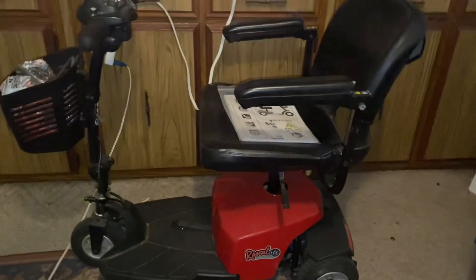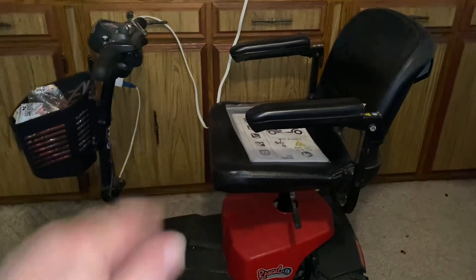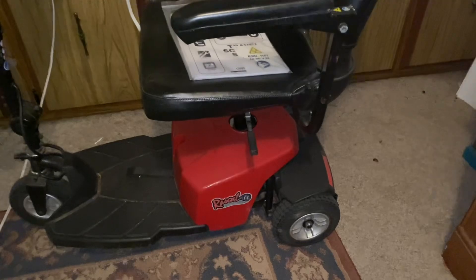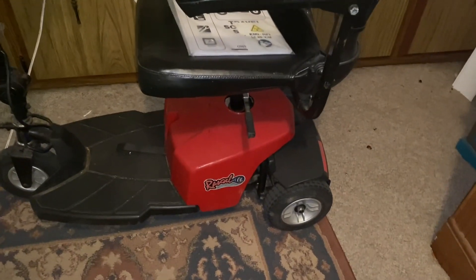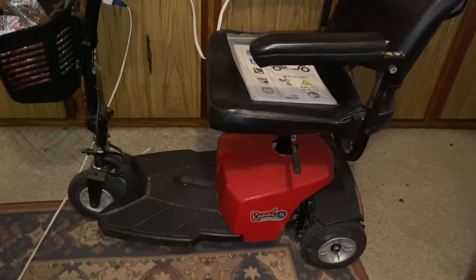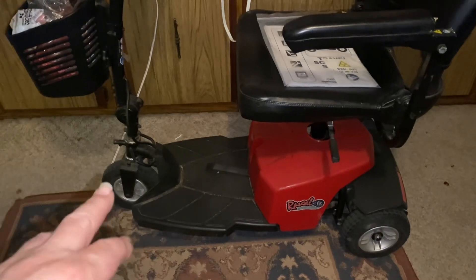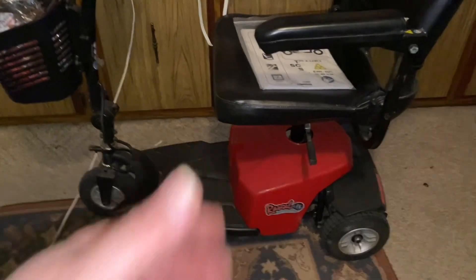The seat comes off — it comes into different pieces so you can fold it up and fit it in your trunk. Now this was my very first one. It was actually my mother's, but I used it because she didn't use it. She tipped over on it and can't ride it because she doesn't know how to stay in the center.